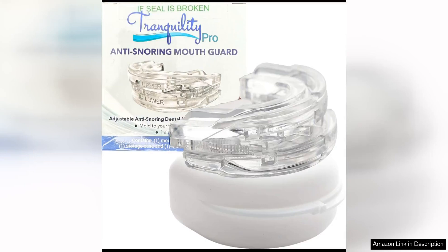The Tranquility Pro 2.0 anti-snoring mouth guard is a game changer for anyone who struggles with snoring during sleep. This adjustable mouthpiece is designed to help keep your airways open, allowing for better airflow and a quieter night's sleep.